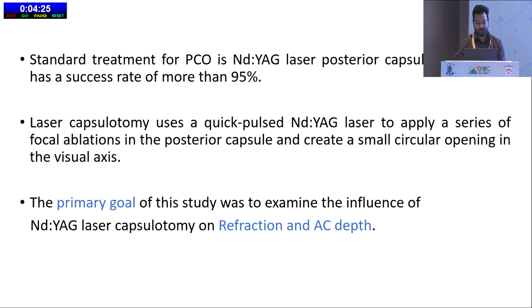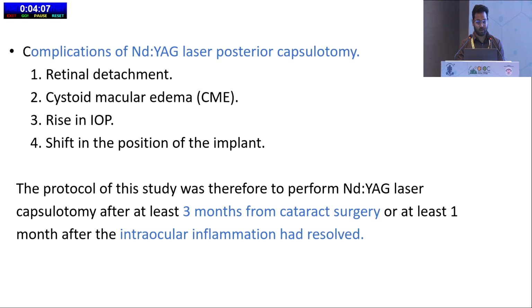Laser capsulotomy uses a quick-pulse Nd:YAG laser to apply a series of focused ablations in the posterior capsule and create a small circular opening in the visual axis. The primary goal of the study was to examine the influence of Nd:YAG laser capsulotomy on refraction and AC depth. The complications of Nd:YAG laser posterior capsulotomy are retinal detachment, cystoid macular edema, raised IOP, and shift in the position of the implant.